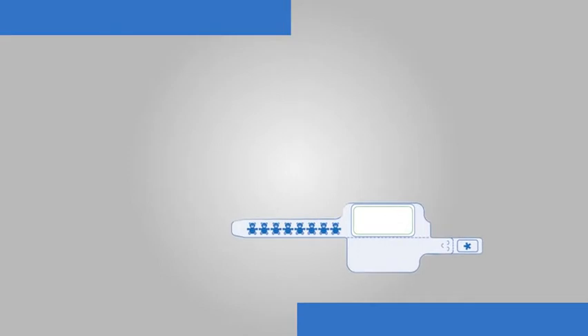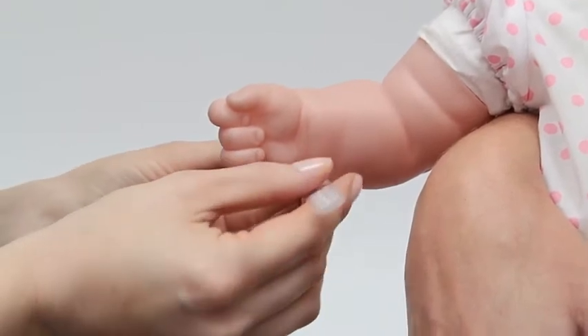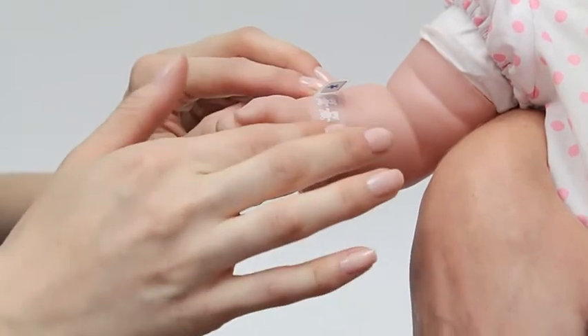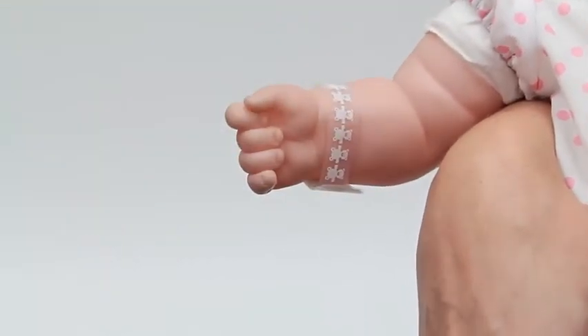Now you're ready to place the wristband on the infant's wrist. Wrap the wristband around the infant's wrist or ankle, placing the wristband over the exposed adhesive tab and press together. Then lay the second adhesive tab on top, removing the asterisk tab at the perforation.